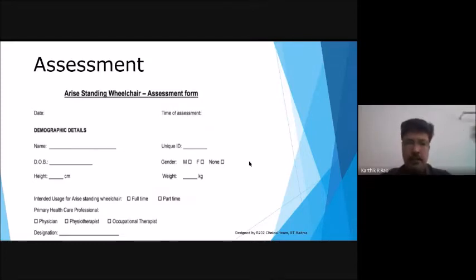Is it full-time or part-time? How is the person likely to use the wheelchair? And based on that, we might give some recommendations.